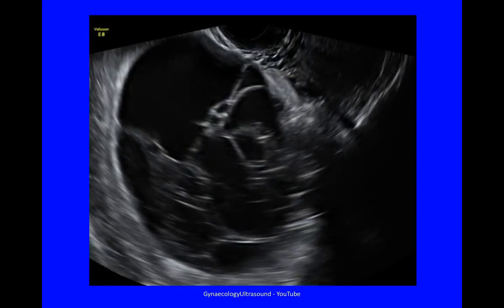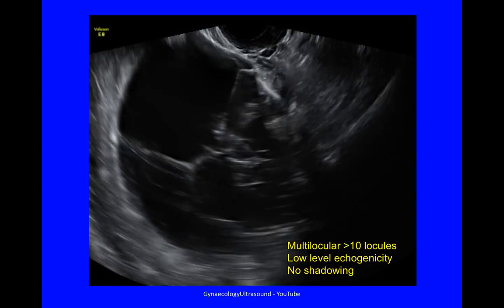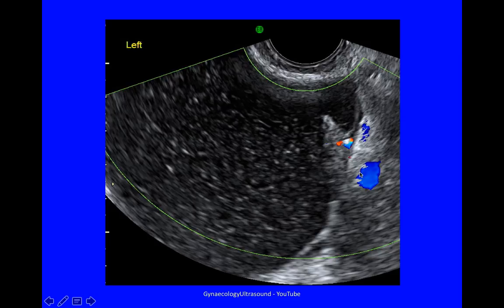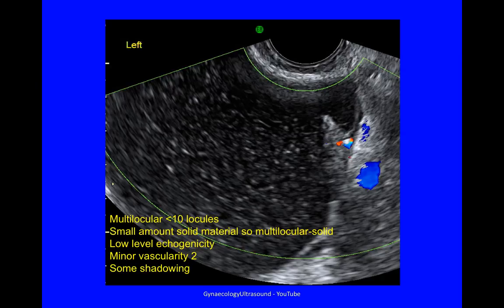Obviously, if you were doing the scan, you'd have more than just a single image and you'd be able to decide more easily. This cyst shows low level echogenicity, and there is a small amount of solid material with a little bit of vascularity and some shadowing. Because it is multilocular with some solid material, it's called multilocular solid. We know it's solid material because it is vascular. If there was no vascularity, it would be harder to confirm, as sometimes you get clumping of mucin at the edges.